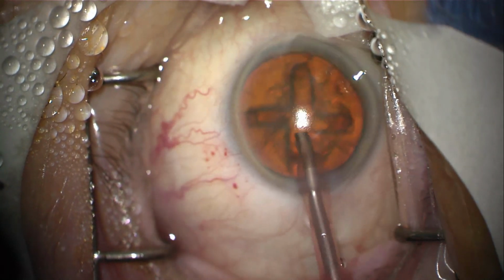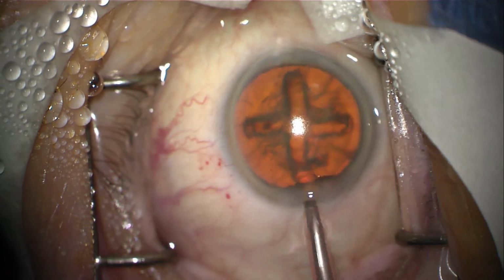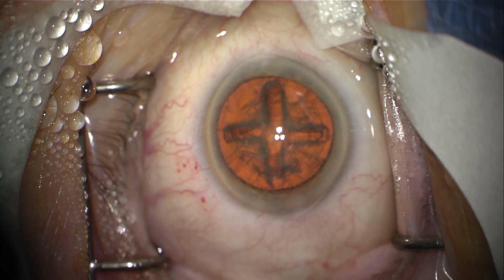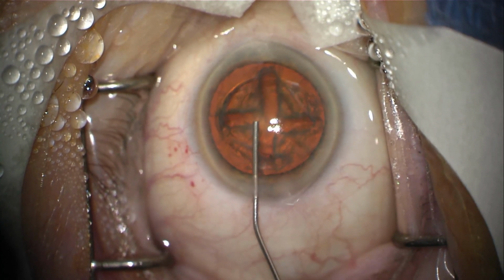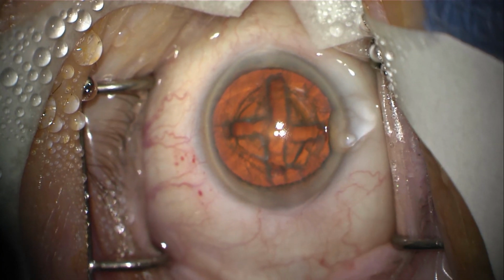Now I have an X. X marks the spot, and I'm going to post this on X.com so it all makes sense. So I have a perfect X now. It's a groove. It's about 90% thick through the cataract. I'm injecting that gel now to basically deepen the eye and inflate the eye so it does not deflate.